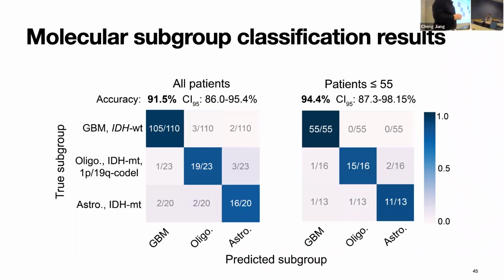Right, I'm missing, in the clinic, you take a genomic sample and then you're predicting with the histology, and you're also then predicting the genomic subtype? No, at testing time in the clinical setting, we only have the images. Okay, so when we have that during training. During training, we have the molecular labels, but in the clinic during inference time, we only have the images.